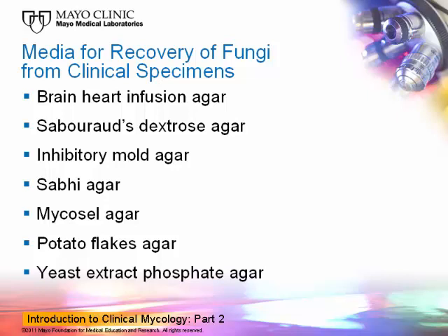Mycosel is Sabouraud agar that contains chloramphenicol and a compound called cycloheximide. It works fine for recovering dermatophytes, but primarily not much of anything else. Potato flakes agar was developed in recent years at the University of Texas in San Antonio. It works fine for primary recovery. Yeast extract phosphate agar will be shown as an example a little later on for how to recover some of the organisms from contaminated clinical specimens.